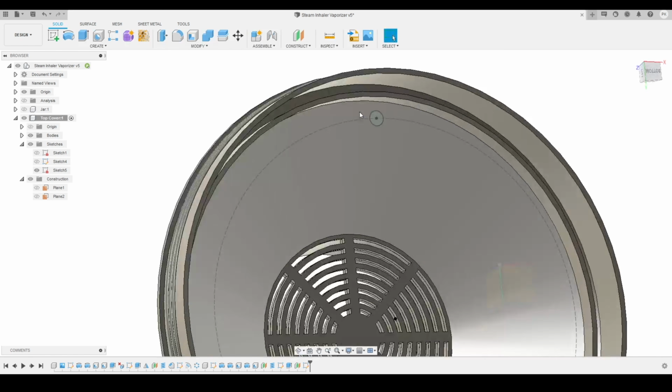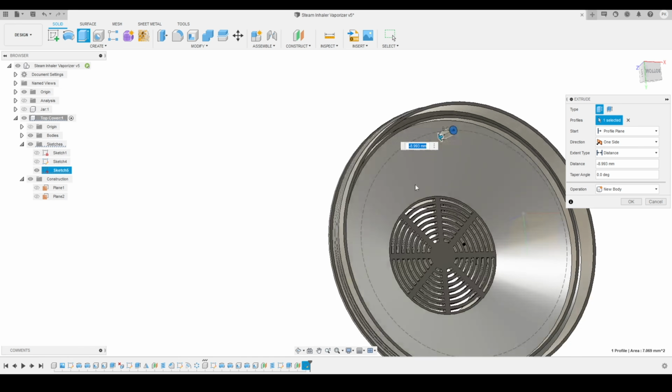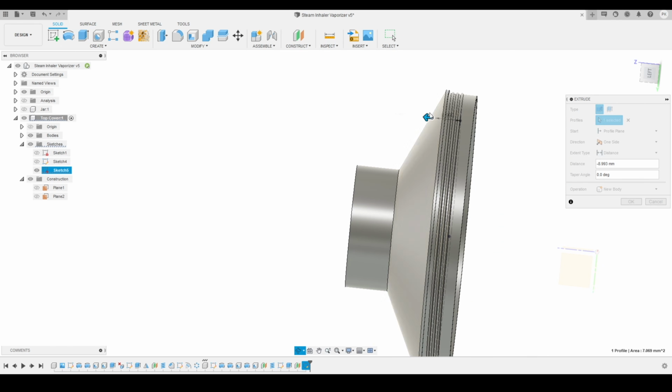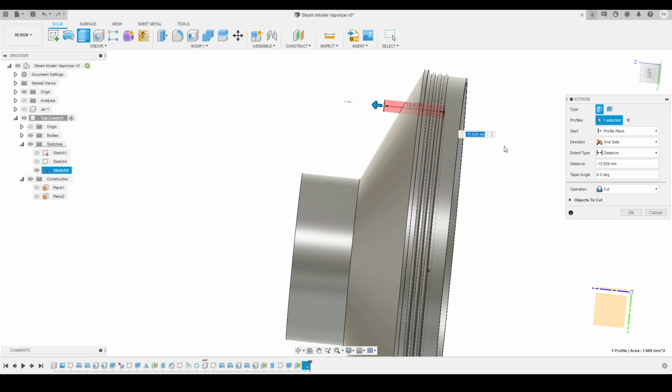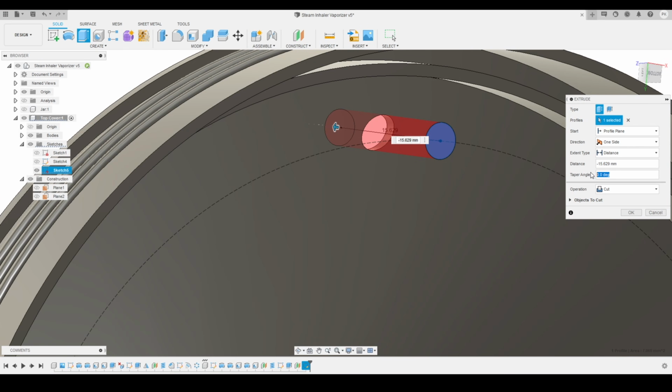So I will just click on finish sketch. We'll activate the extrude tool. Instead of making a cut, I will make sure I'm making a new body here, and I will make sure that it is completely passing through the body. Then we'll provide the taper angle.